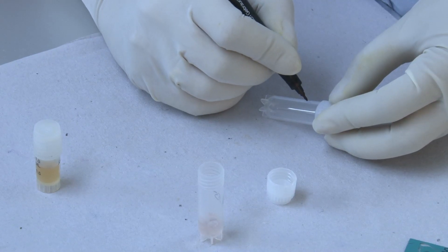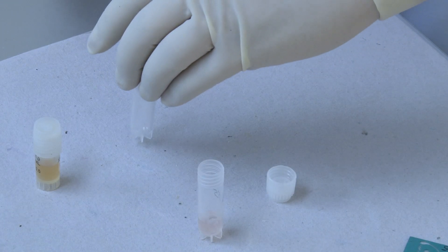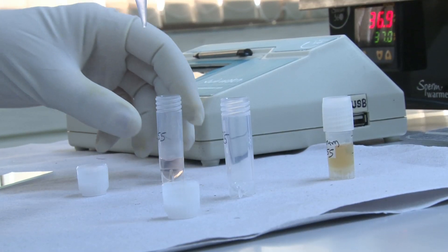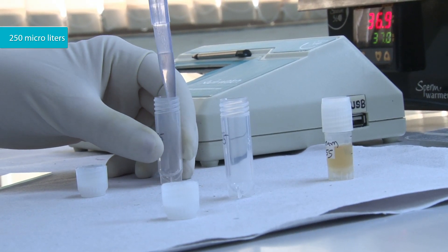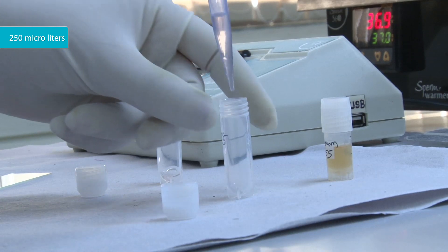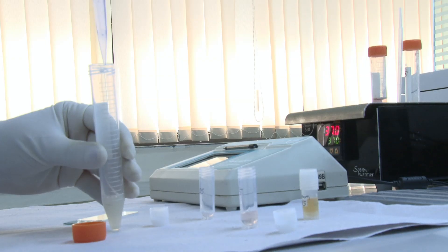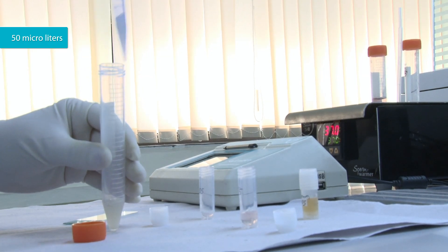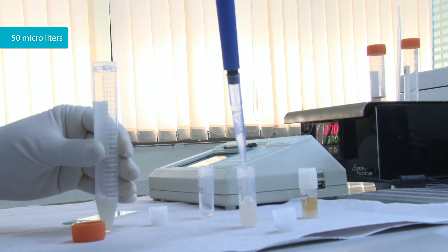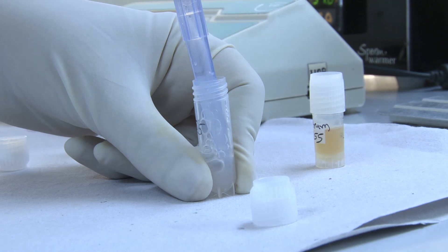Take another tube and label it with an ID. Put 250 microliters of diluted serum in the tube. Add 50 microliters of donor semen to this tube and mix it well.